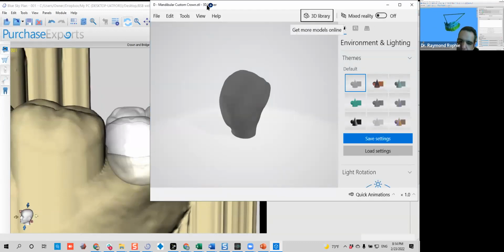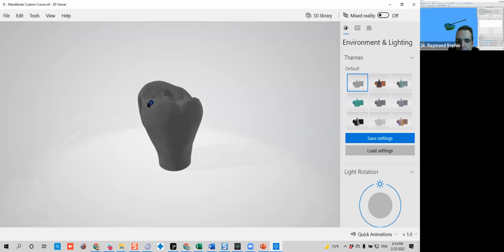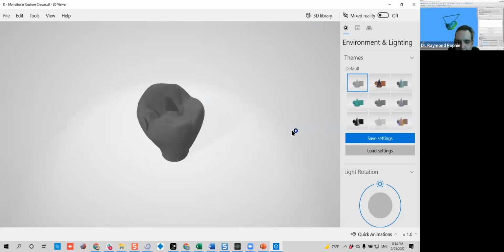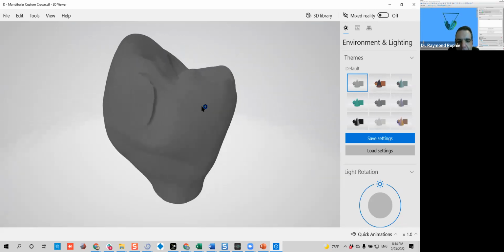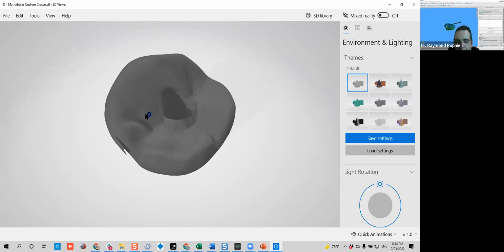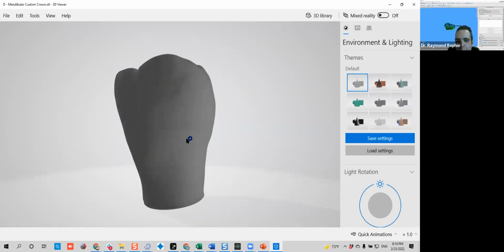For the finishing of the surgical guide fabrication, I'll just finish right now. Actually, no, I can't because it's frozen. But you can just follow what Dr. Mickley did last time, or I can do it on this other case. For example, if I have this defect on my tooth, it will take me like 5 seconds to remove it with a burr, or you can go back to the software and do it. It will just take more time, and I really like more efficient workflows.